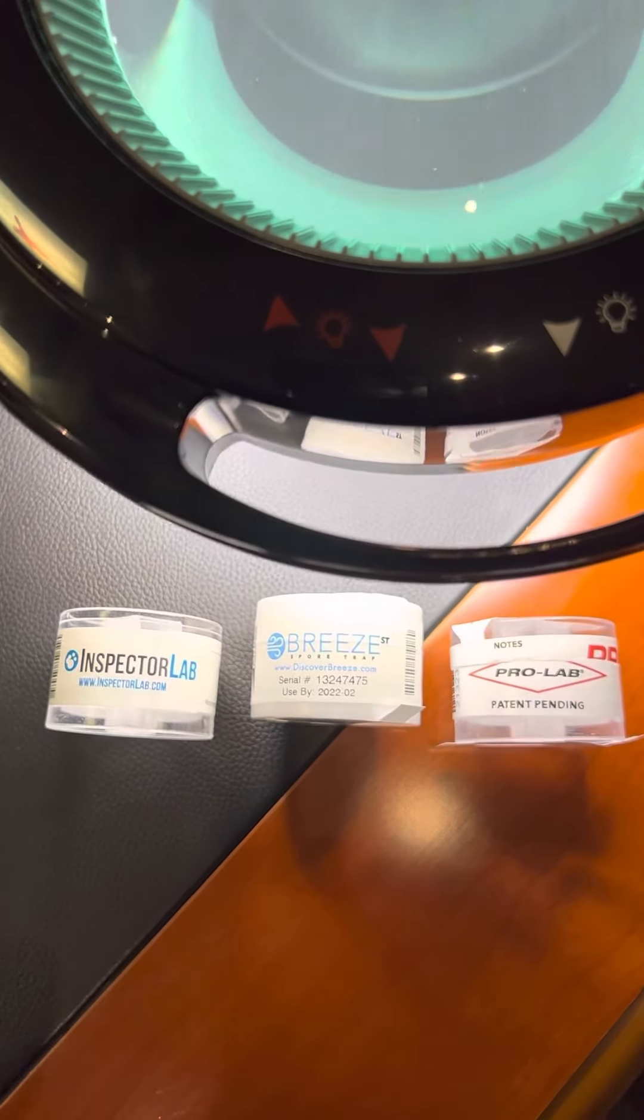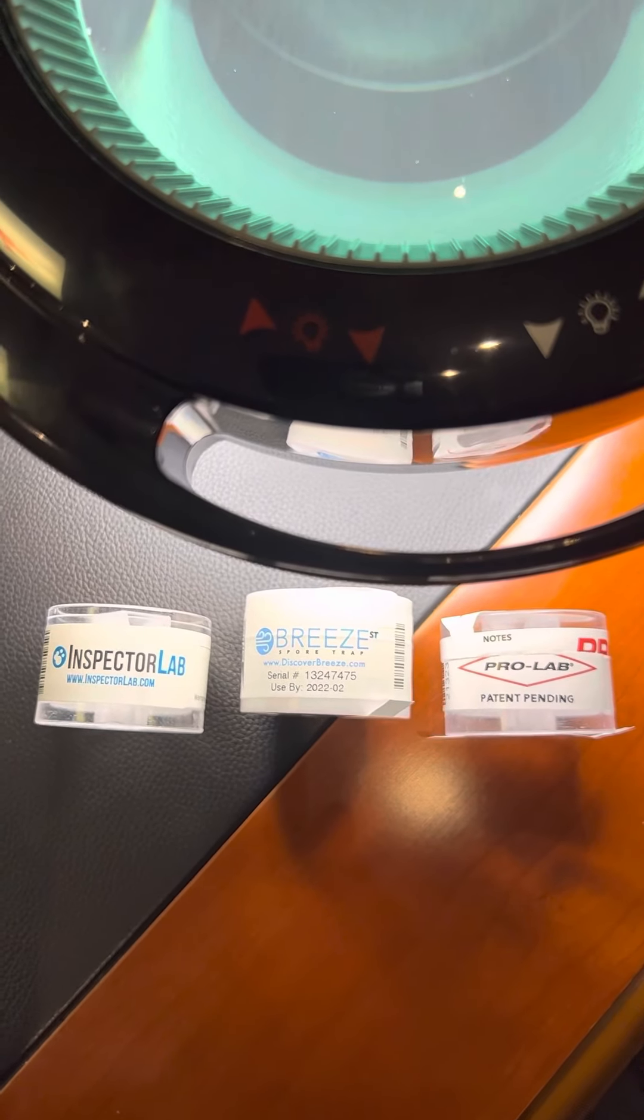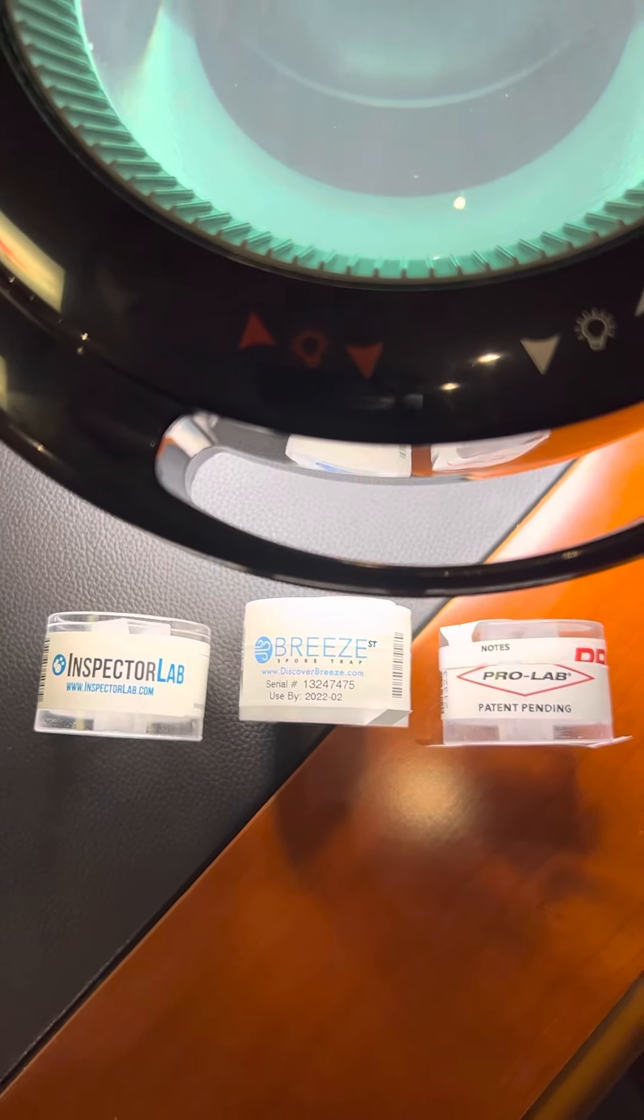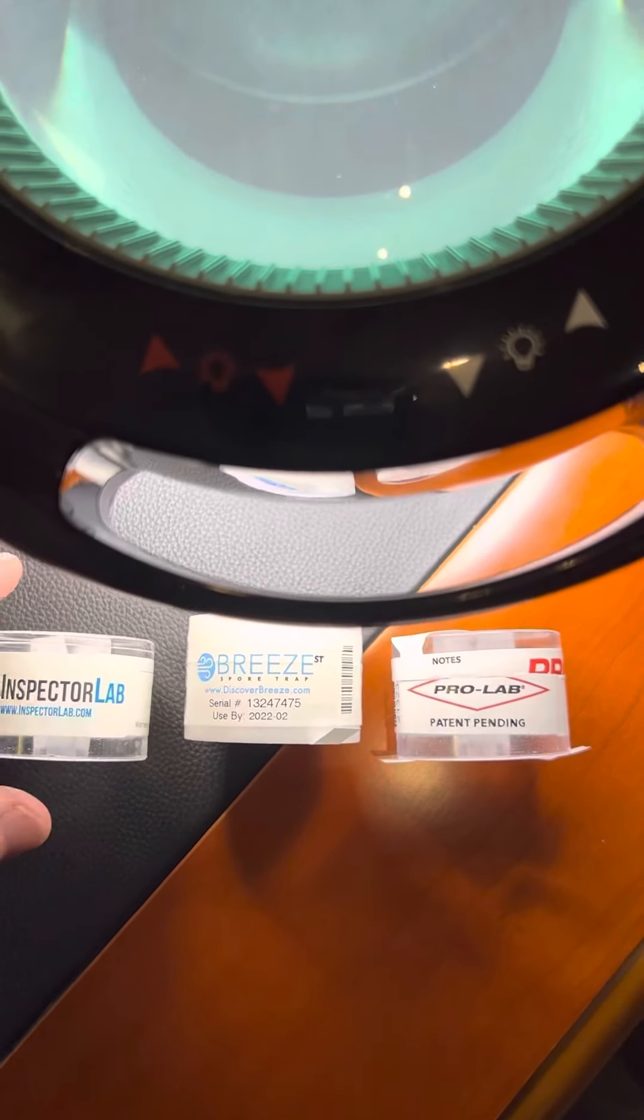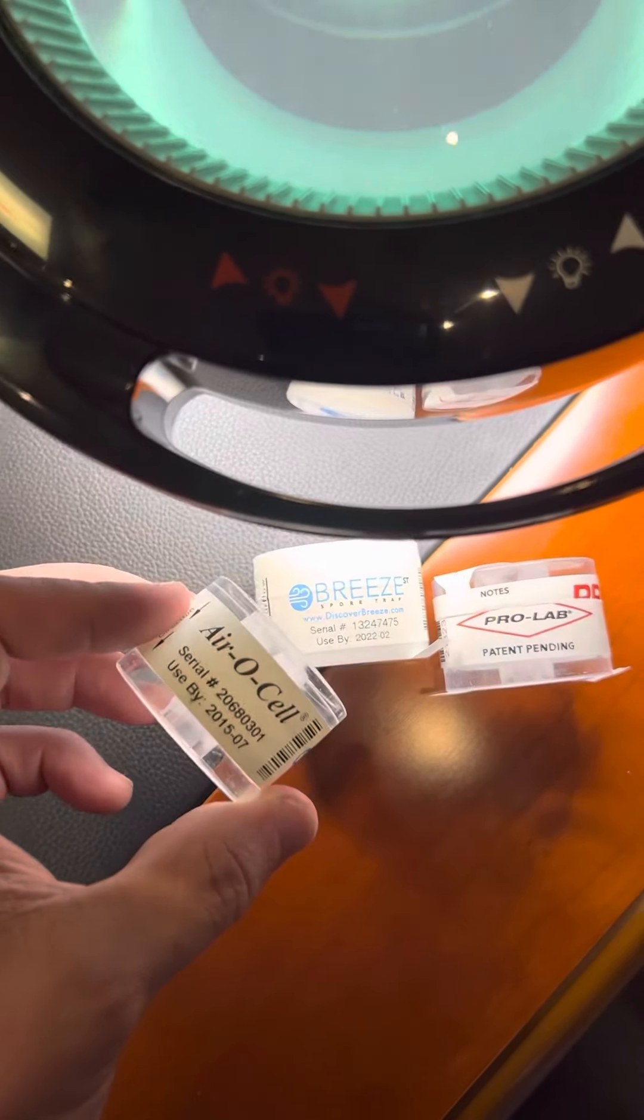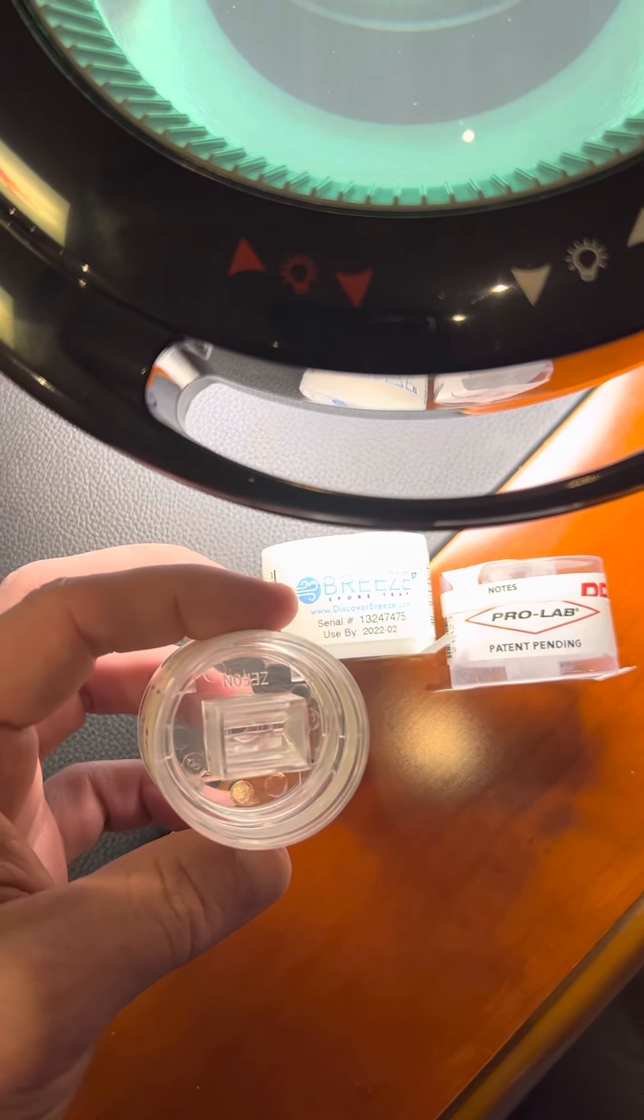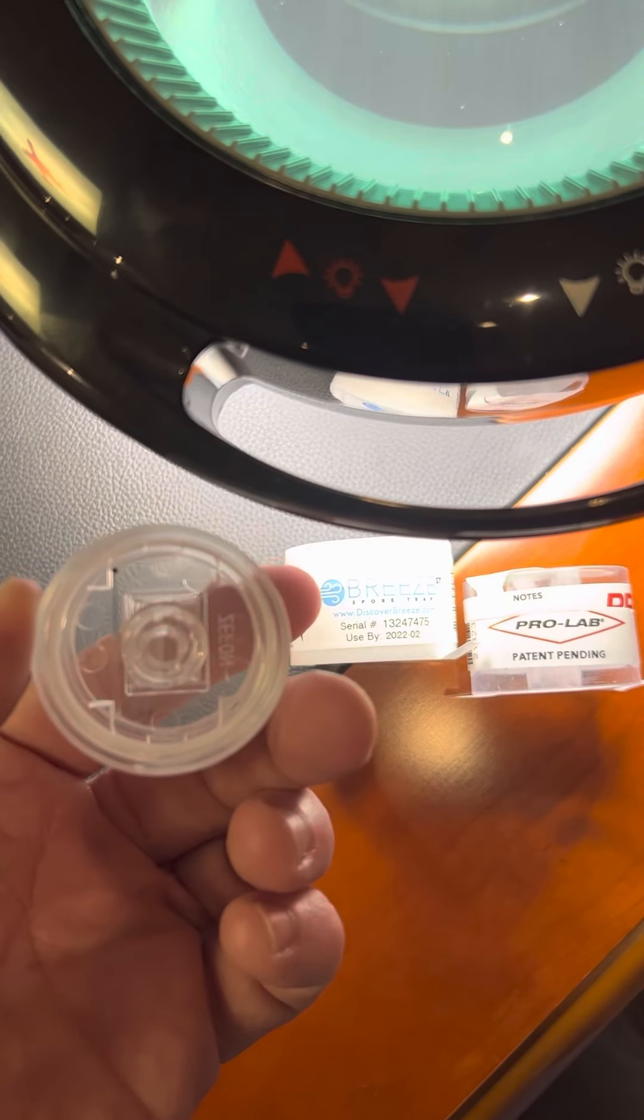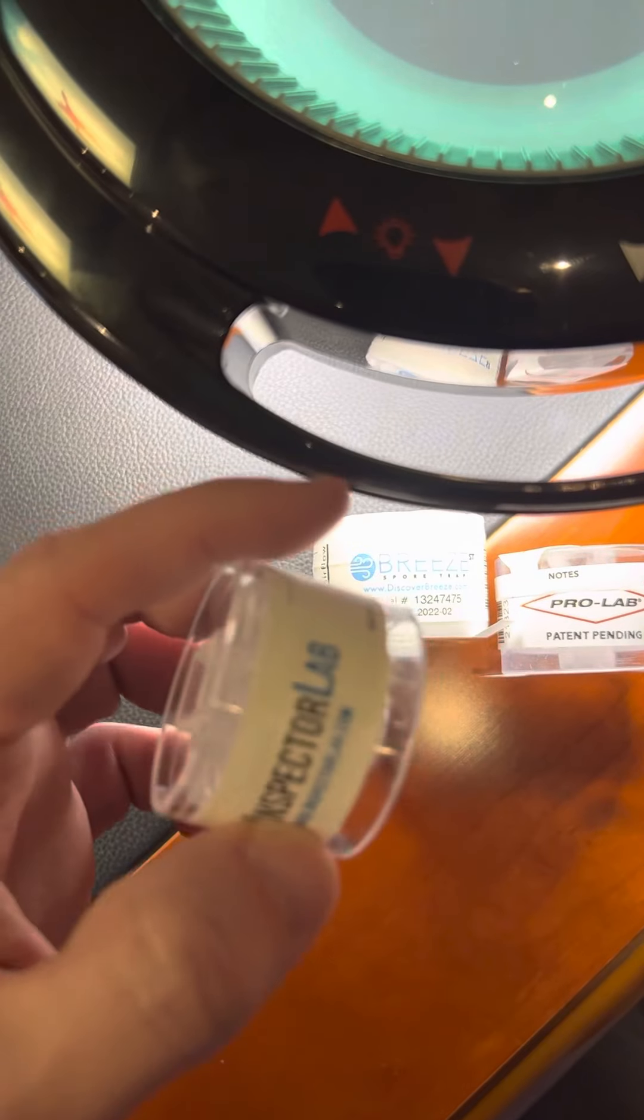What I want to show you here are three air indoor air quality cassettes and show you a little bit about the kind of quality that you can expect from ProLab. So this is the first example here, this is an Inspector Lab branded AeroCell from Zefon. We were probably one of the largest purchasers of these in the country and we're very familiar with them.